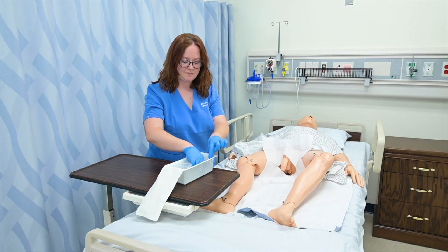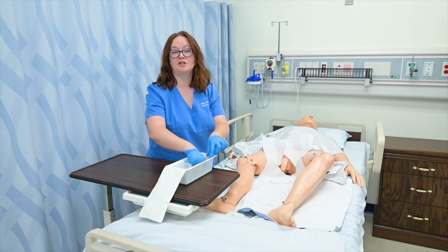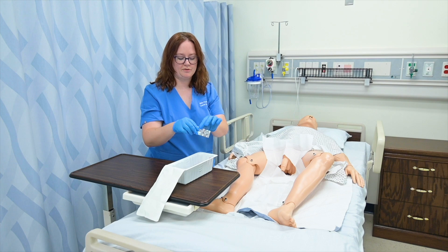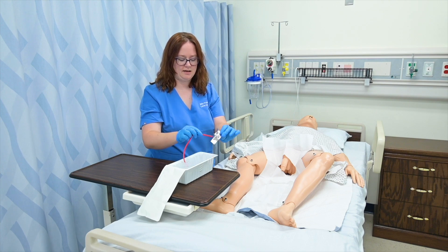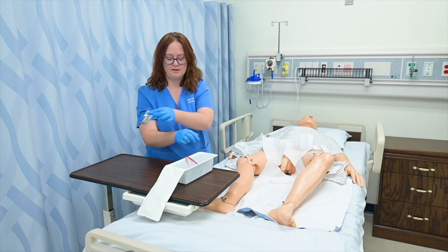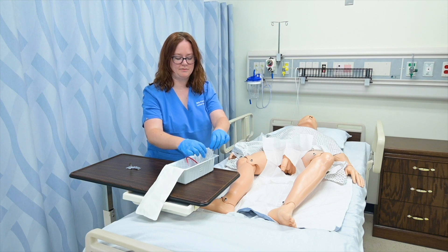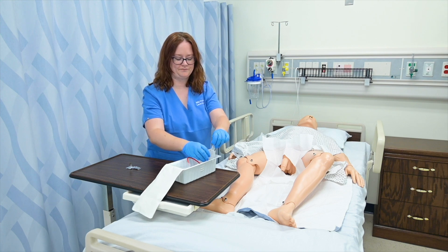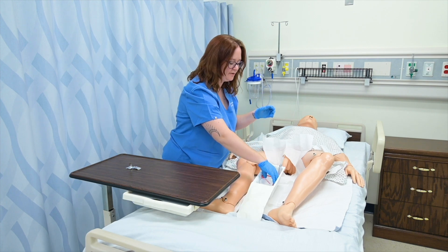Then all that's left in here are going to be my swab sticks, my lubricant, and a sterile collection container if I need to collect a sample. I'm going to go ahead and open that lubricant and insert the catheter into it so it's generously lubricated. Then I'll get my swab sticks ready and move this tray down here.